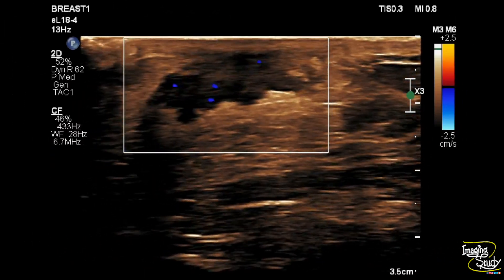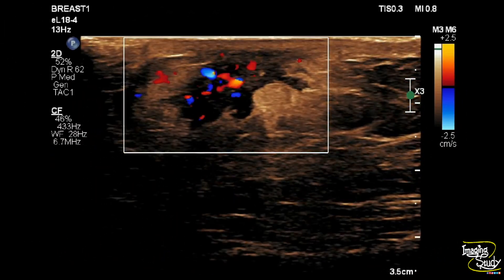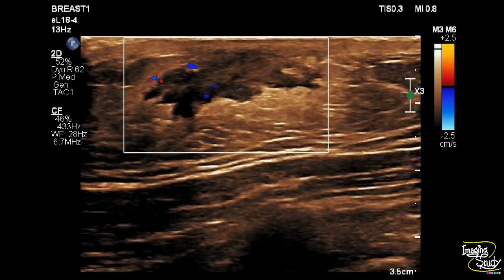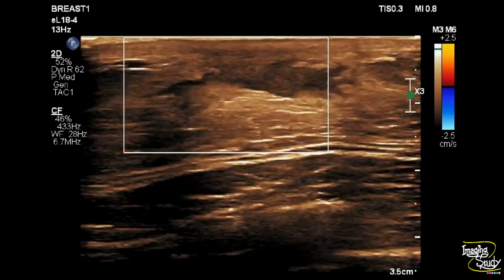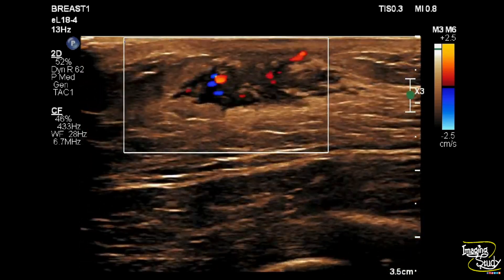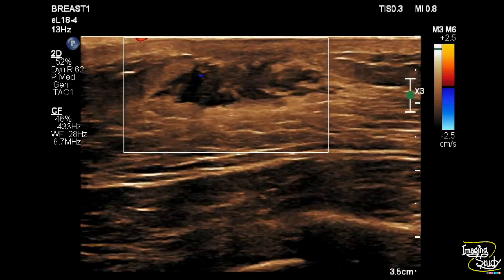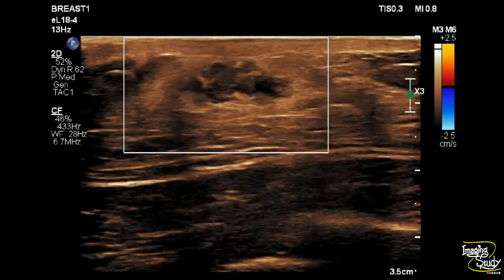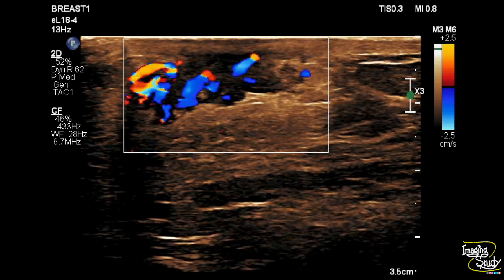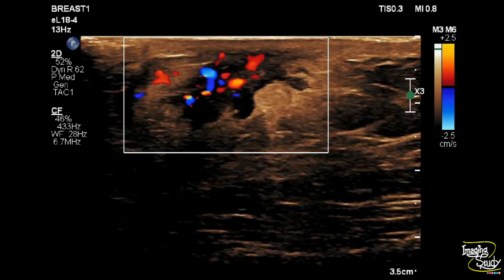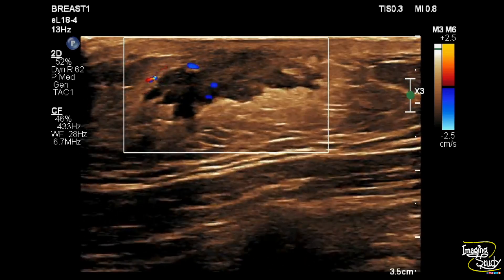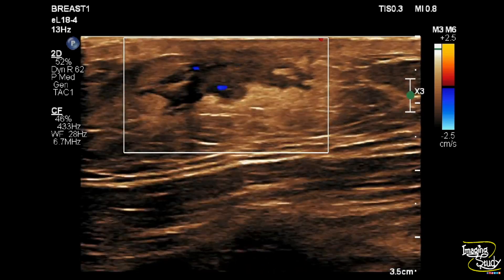Here's another picture where we have decreased the scale, or pulse repetition frequency, and you can see the vascularity is very high. In a normal breast, you won't see this type of vascularity even if you decrease the pulse repetition frequency.